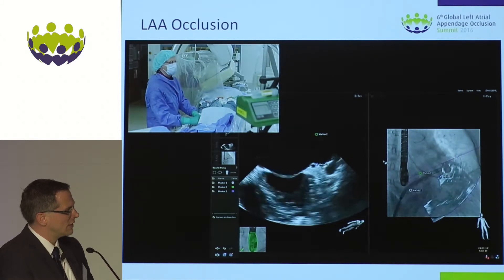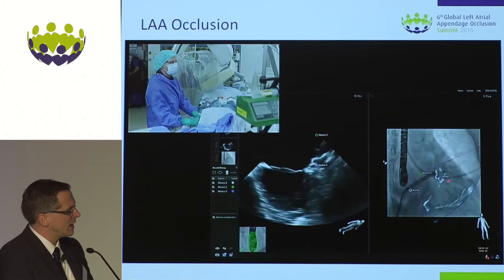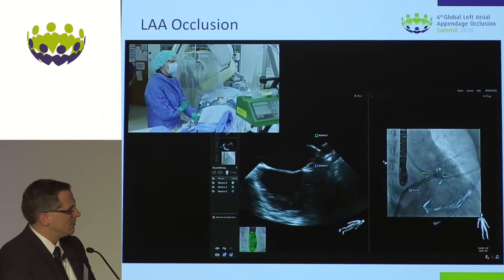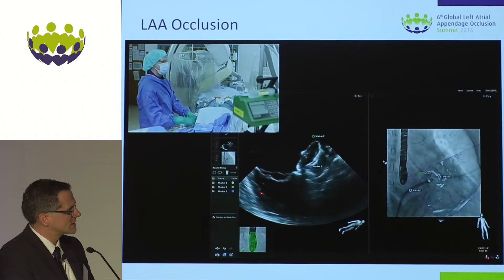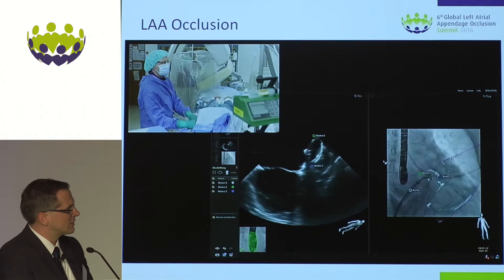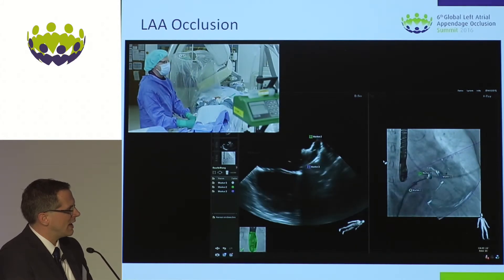We tried to turn counterclockwise to get it more to the one o'clock position and to get it deeper inside. With this overlay it's just intuitive to see where my lobe is and where the left atrial appendage structure is. Even if you prefer the pure echo view at this part of the procedure, you have it on the left side and may consider positioning again in echo.